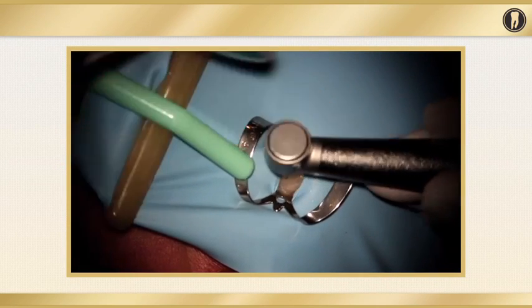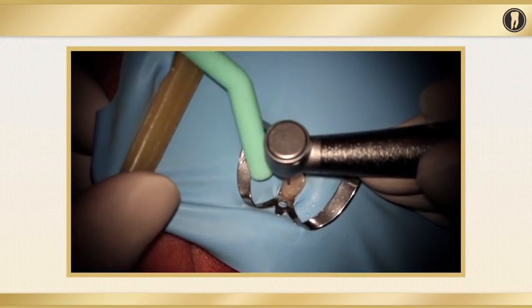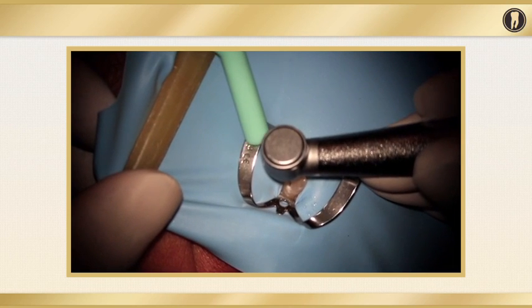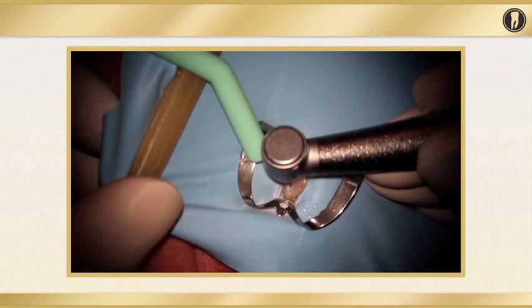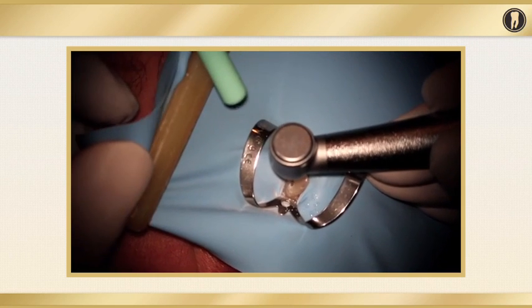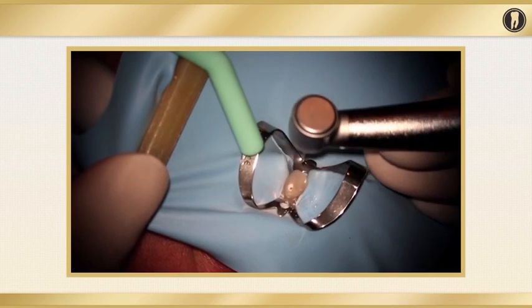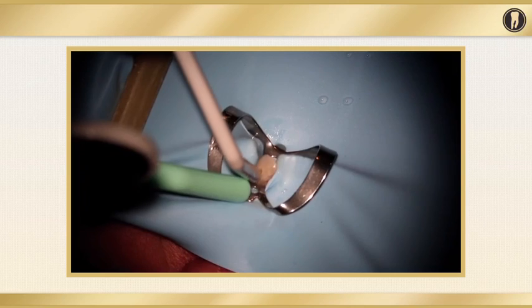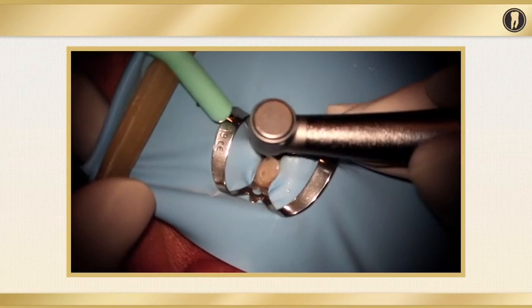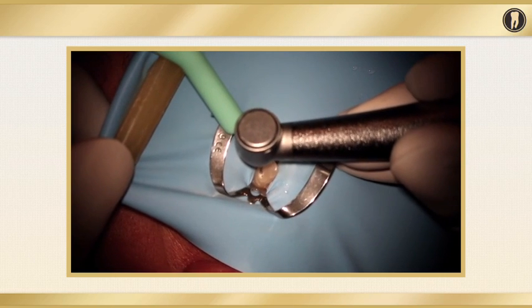All right, here's an interesting case. You have a tooth number 10 that's severely rotated. My lingual access is blocked, so I'm unable to access this tooth lingually. So what do I do? I have to do a facial access. I use my 330 long carbide burr, and I start on the facial, the same exact spot as on the lingual, but just on the facial. I have to be a little more careful because it's different from what we're used to, but you're doing the same thing.